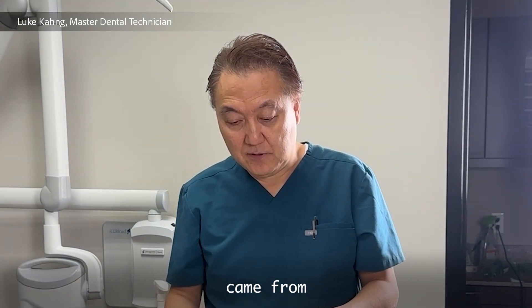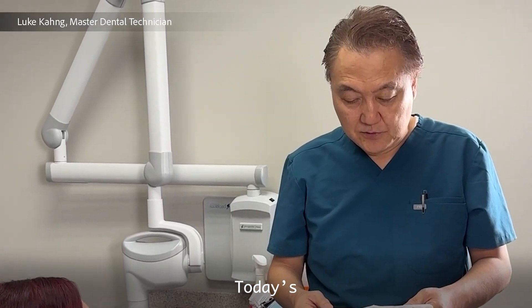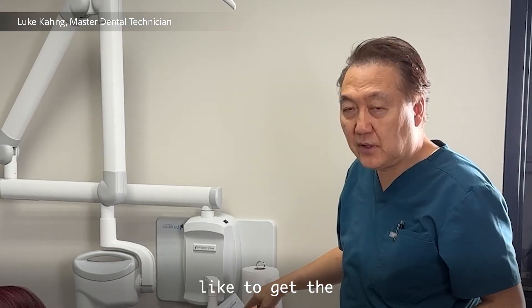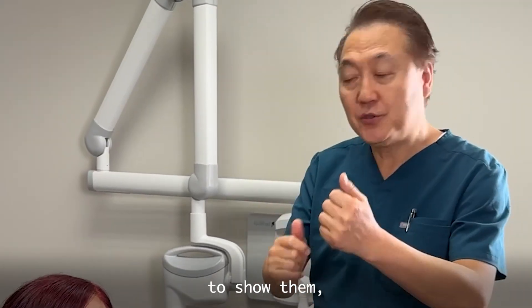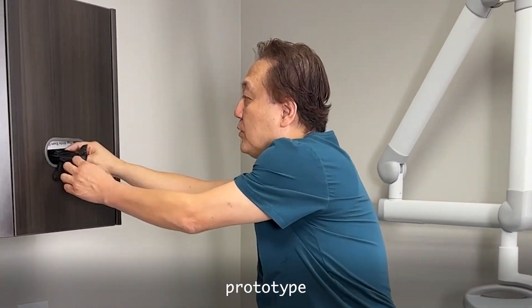This patient came from St. Louis. Today, let me see the doctor's prescribing information. So we would like to get the smile. I'm going to show them the prototype today.